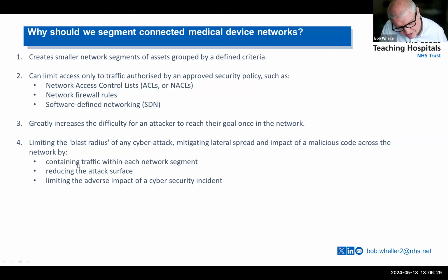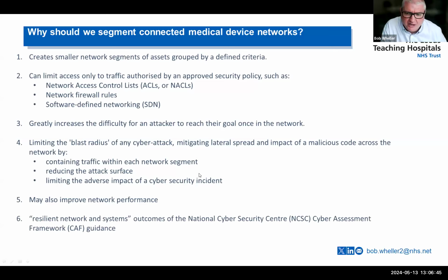It can limit this by containing the traffic within each network segment. It can reduce the attack surface, and it limits the adverse impact of a cybersecurity incident. It may actually, as a side effect, make the networks run better and improve network performance.